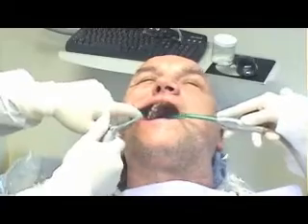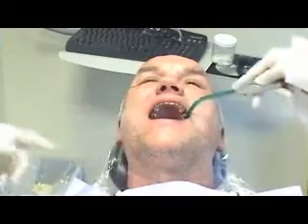Give me a little rinse here. He actually has an X-ray. Can you pull that off? Kurt, we're going to let that kind of... go a little around, come back, give you a round, so we'll get started.